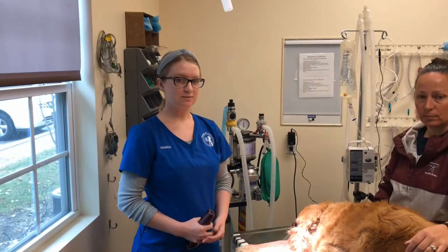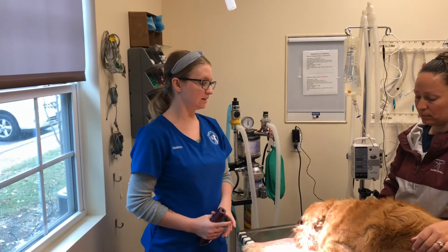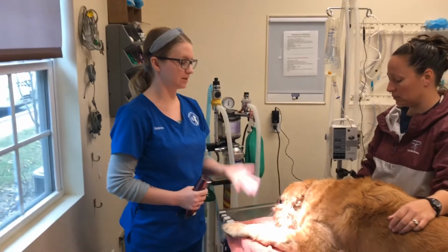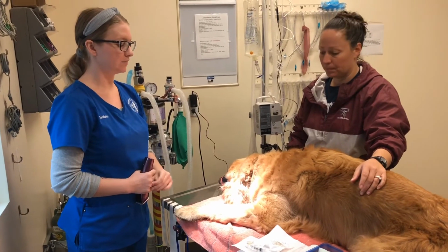Okay, now I'll be demonstrating the placement of an IV catheter in a cephalic vein of a canine patient. This patient has been sedated and he's about to be hooked up to anesthesia. He's wearing a muzzle for protection of myself and my restrainer. This is Dr. Lisa Hansen. She's my preceptor, and she'll also be holding the dog for me.